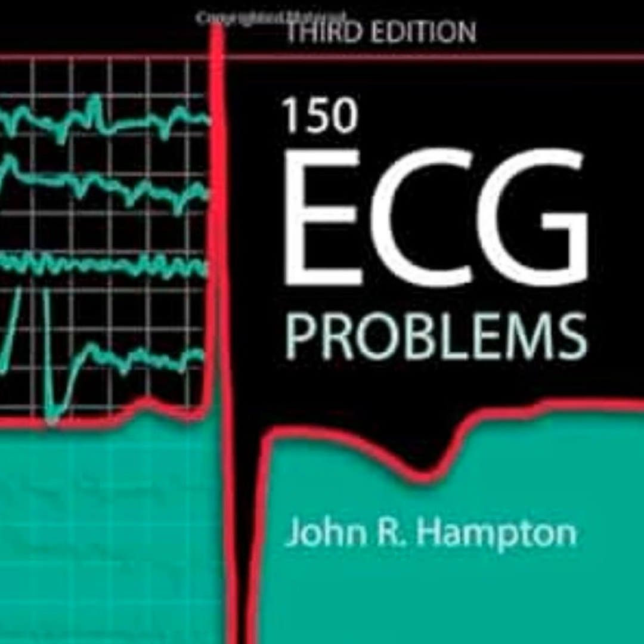The ECG can only ever suggest hypertrophy based on voltage amplitude, but the echo uses ultrasound to directly visualize and measure the actual physical thickness of the ventricular walls and the interventricular septum, like in millimeters. So it takes the guesswork out. Completely. It tells you definitively if there is structural pathology that's actually obstructing the outflow tract. Basically, we use the ECG to flag the anomaly, but we use the echo to diagnose the reality.